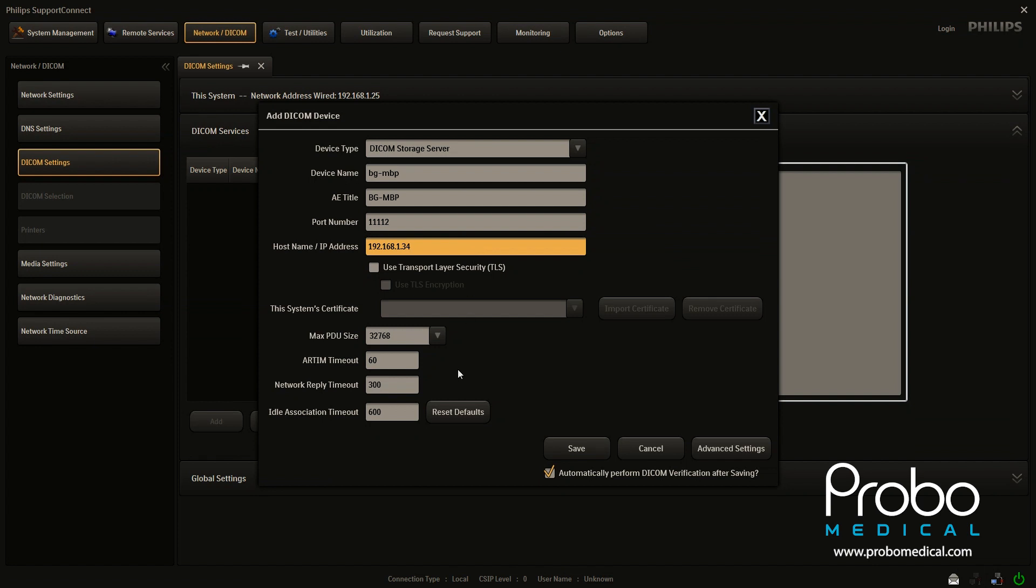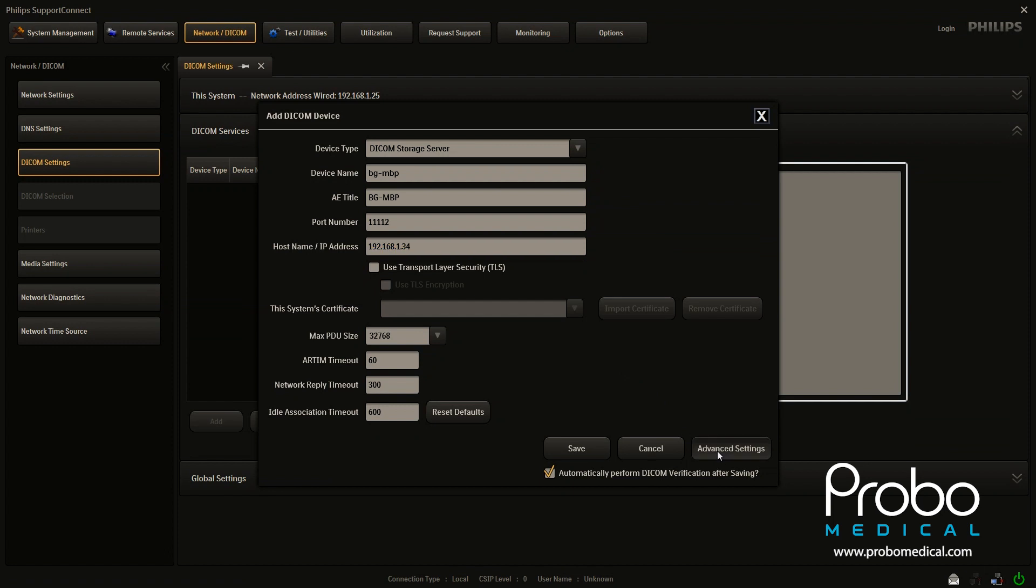I have never had to alter any of these settings on an Epic. I have in the past had to do that on some other units, but never on an Epic. So before we go any further, we're going to slide over to advanced settings though.